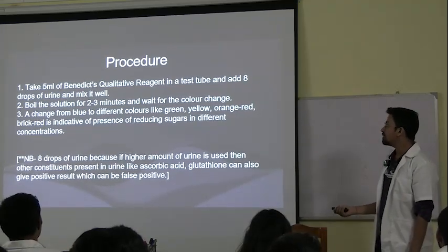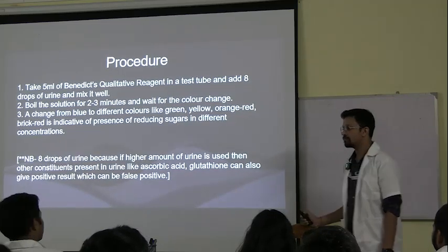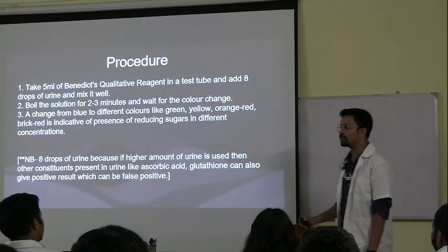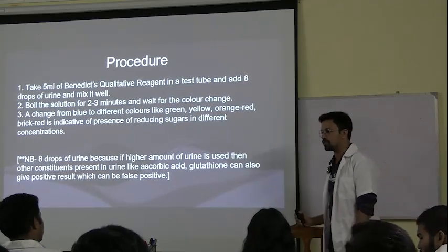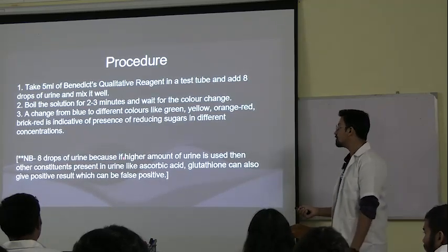Now, somebody may ask, in last class also someone asked me, why 8 drops of urine? Why not more than 8 drops? Why we cannot use more than 8 drops of urine sample during the test? We can use 6 drops as well, we can use 10 drops as well. Why 8 drops only?